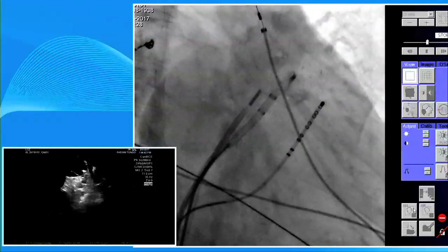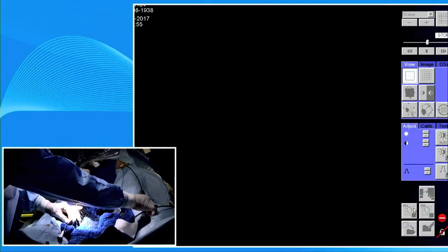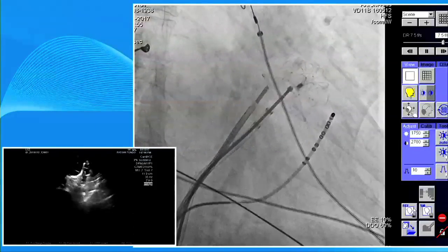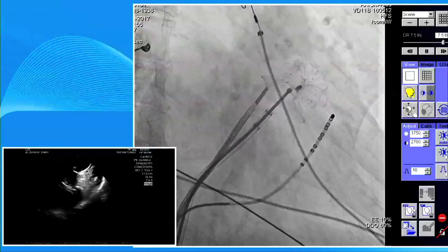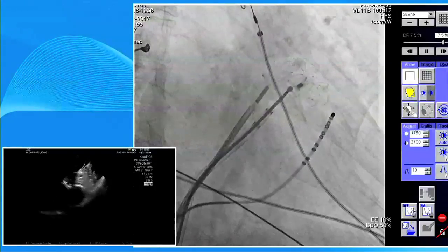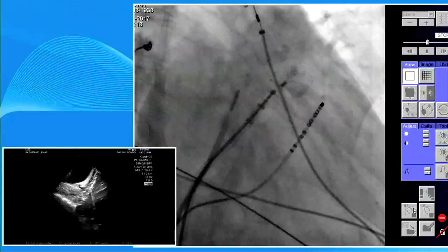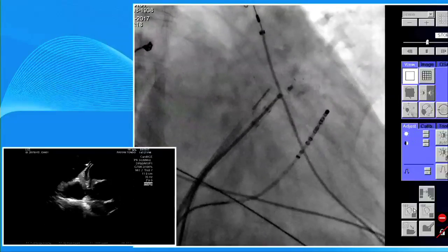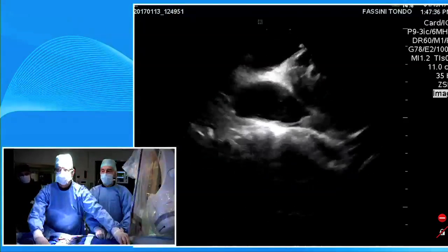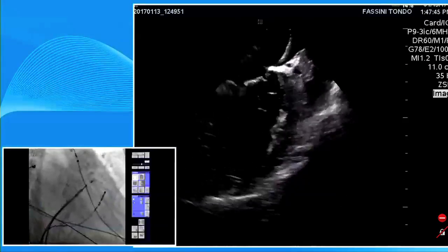One feature of the device is to have a concave shape of the cover. You have a nice view on the ICE with the cover sealing the entrance of the left atrial appendage. The ICE moved a little bit when I pushed the device into the appendage. Gaetano is just trying to regain the same position. It's always interesting on the ICE in the left atrium - you get such good views, but you are so close to the appendage you have to move back away. Posterior deflection sometimes.